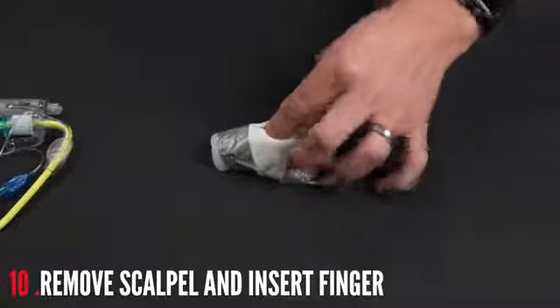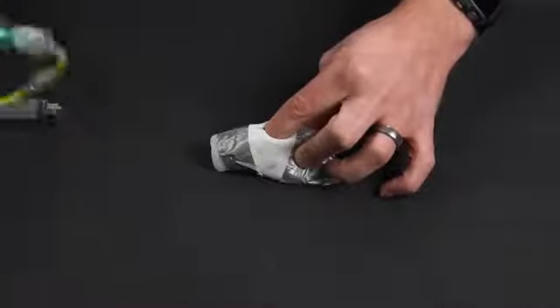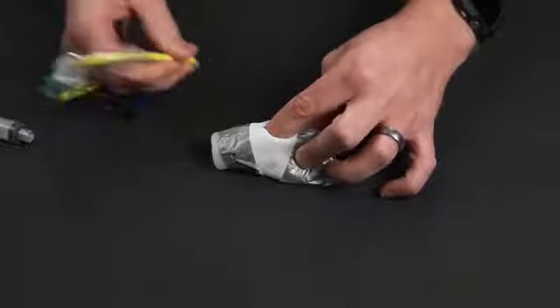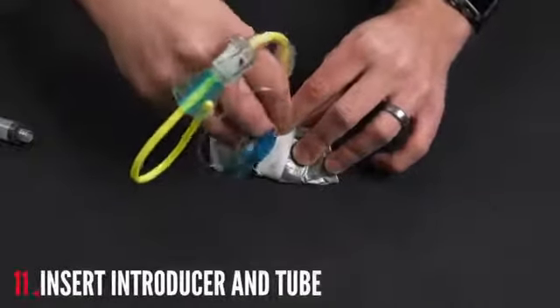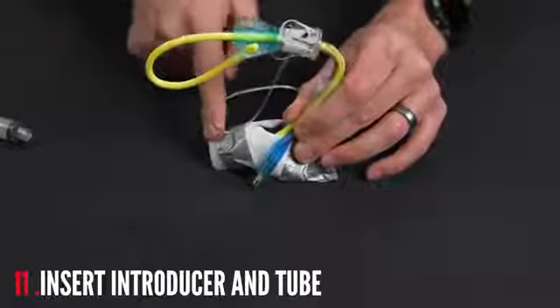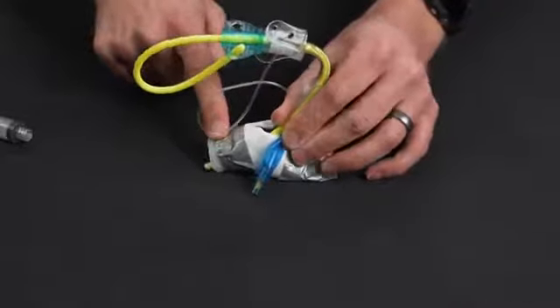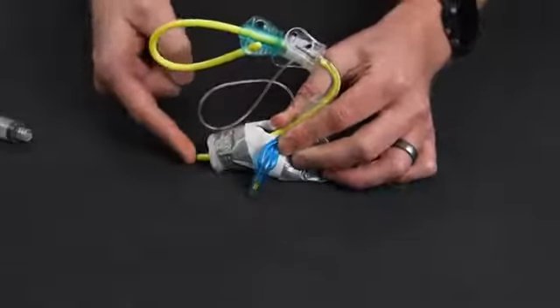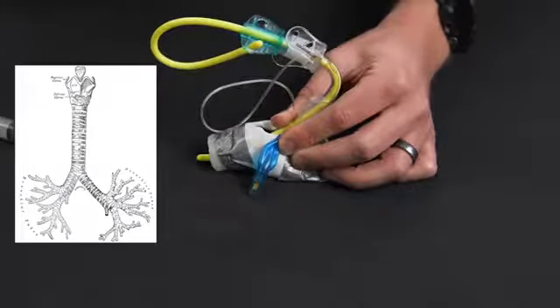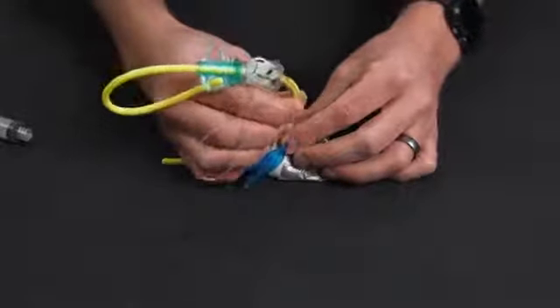I'm going to take my finger and I'm going to put it in there. I should be able to palpate the tracheal rings as a confirmation tool. I can then take my tube with the bougie preloaded, and I'm going to just take the bougie and slide that in next to my finger. As we go in, that coude tip, that little angled tip of the bougie should start bumping off the tracheal rings. That's another confirmation technique. As we put this in, eventually the bougie, if it's in the right place, is going to hit what's called the carina, which is the bifurcation where your bronchioles come off onto either lung. That should hit that and it should stop. I'm then going to take the tube and I'm going to feed that over it.